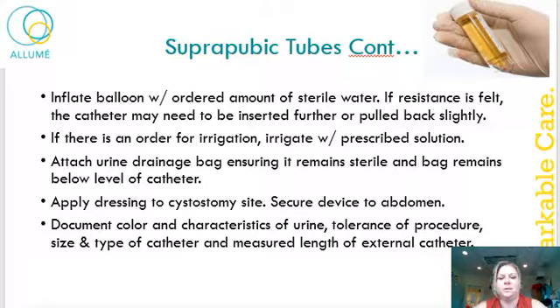Secure the device to the abdomen. Document the color and characteristics of urine, the tolerance of the procedure, size and type of catheter, the balloon volume, and measured length of external catheter.